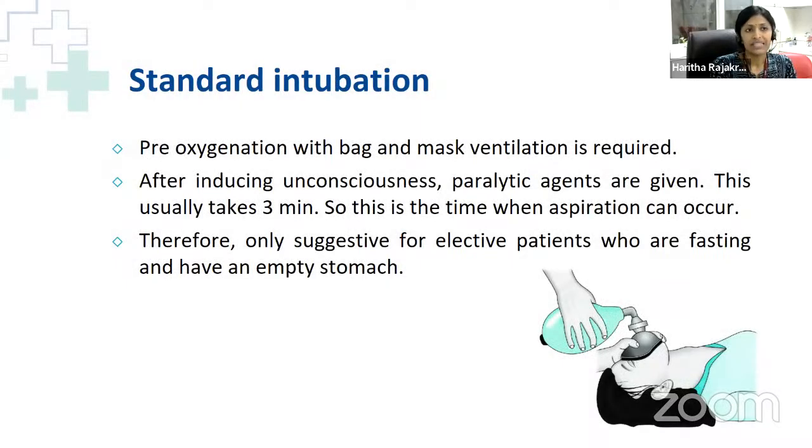During standard intubation, the first step is pre-oxygenation with bag and mask. Again, most of you must be familiar with this. Most of you must have seen it, at least in different series or movies. Pre-oxygenation is the most important step here. Why is pre-oxygenation important?